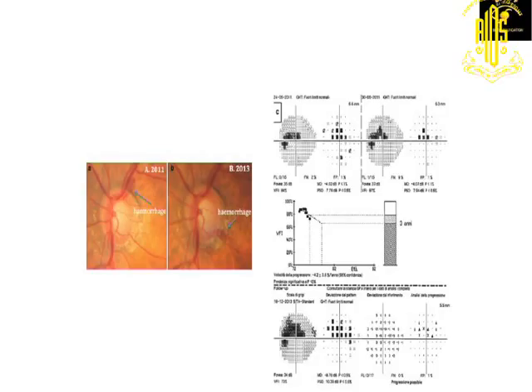Next we move on to this. The diagrams are small out there. So this is where you have the hemorrhage, and then you have the follow-up of this hemorrhage, and when you see them on the visual field, this is what the visual field will actually show you, the progression of the patient. So this is a diagnostic factor on the visual field when you see progression on your disc charting.